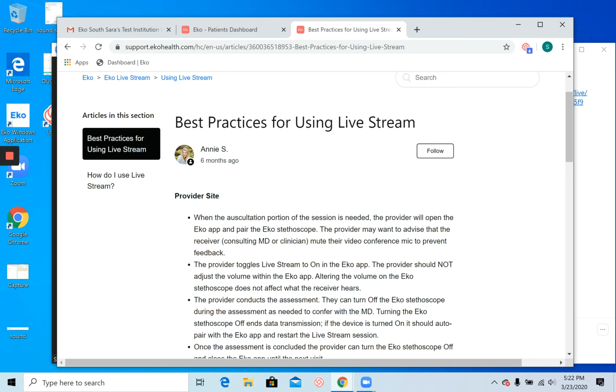When listening to the live stream, it is important to make note of a few best practices. First and foremost, the live stream is only accessible from Google Chrome, Firefox, Safari, or Microsoft Edge. The live stream will not work with Internet Explorer. We always recommend listening to the live stream using high-quality wired headphones, as external computer speakers are not optimized for lower frequencies.